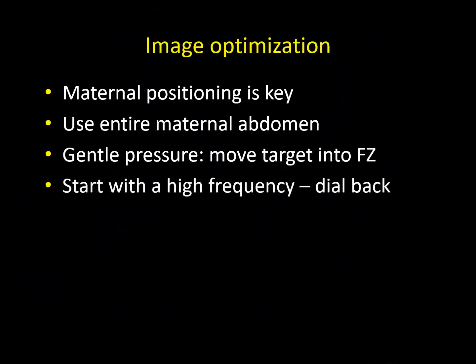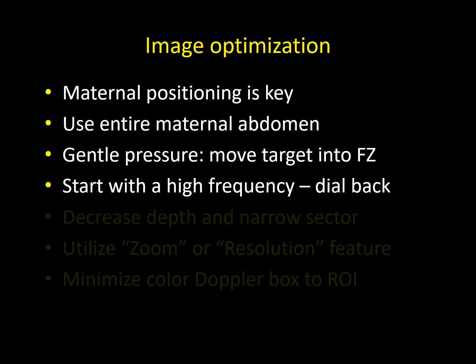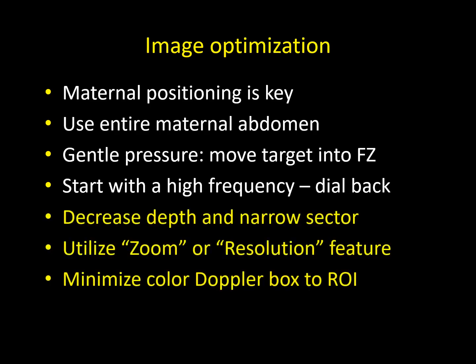At the same time, you want to start with a high frequency and then dial it back throughout the exam if needed, and you want to decrease your depth and narrow the sector. Also utilize the zoom or resolution feature, which I've shown there, and minimize the color Doppler box to the region of interest you want to image.